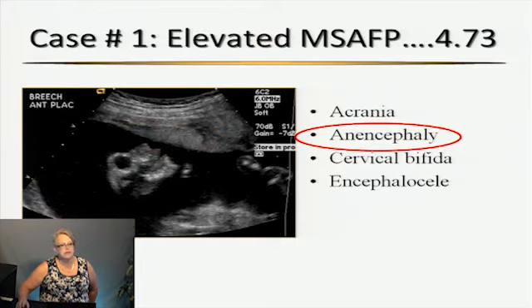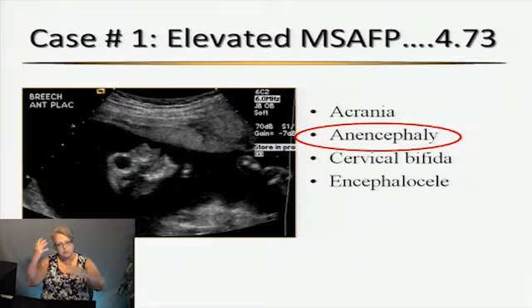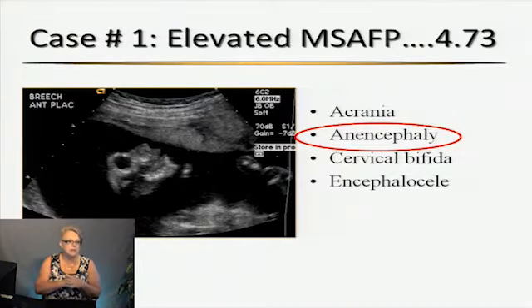So it's your anencephaly, that's that typical frog eye appearance. Most of these, when you scan them early on, it's actually an acrania. There's no calvarium there. But as the neural elements, the brain, is exposed to the amniotic fluid, the little particles you see floating around in the fluid is what's left of the brain. It's floating around in there. So by the time that they are delivered, it is an anencephalic.